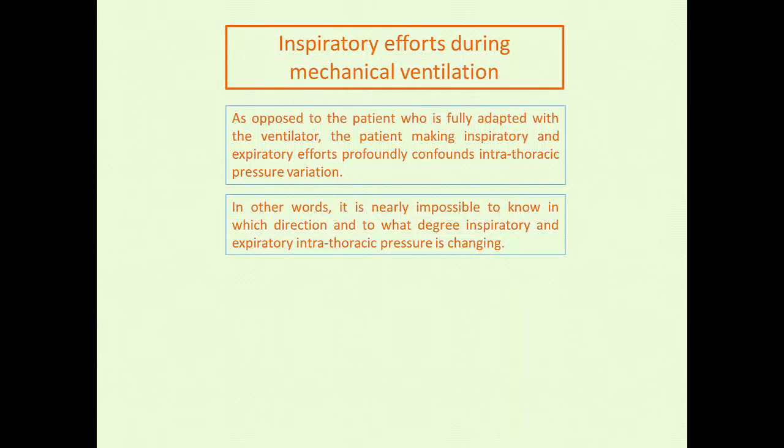And this patient is still subjected to all of the same caveats like we just talked about, particularly patients who are in heart failure states who are very sensitive to changes in ventricular compliance and afterload. And then superimposed on that, you have this varying intrathoracic pressure, which will change your inspiratory D-up versus D-down and expiratory D-down versus D-up.